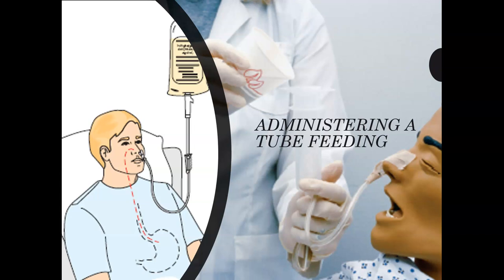Okay, so now we're going to talk about administering tube feedings. This is very important that we know how to do this safely. We will have a lot of patients who are getting tube feedings if they are having issues with swallowing. Also, patients in the ICU when they are on the ventilator, intubated, sedated.